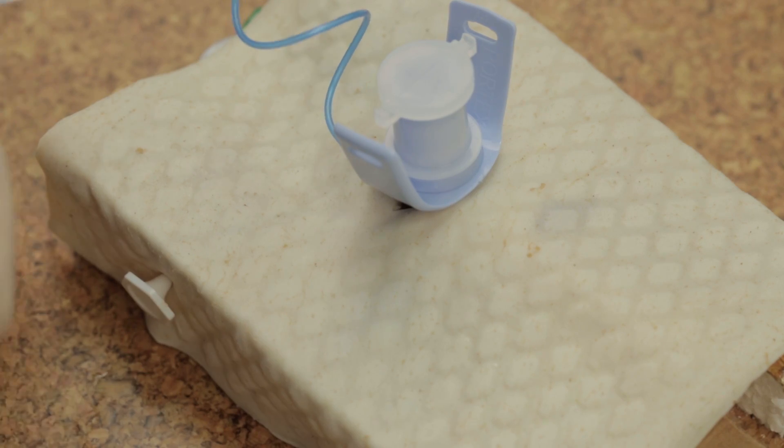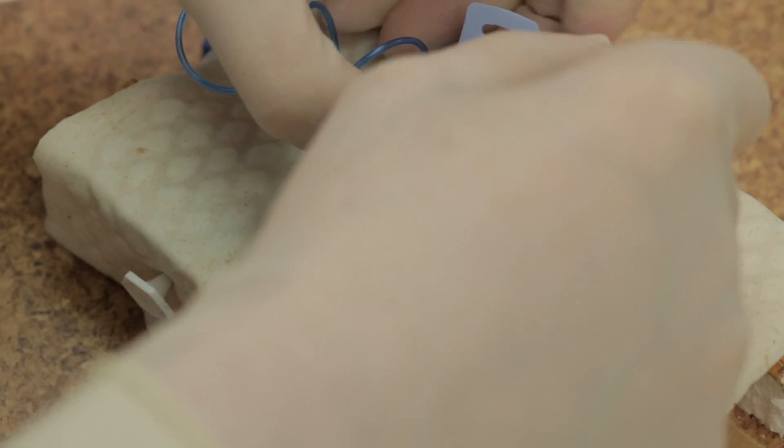Remove the stylet. The tracheostomy tube can then be secured in place.